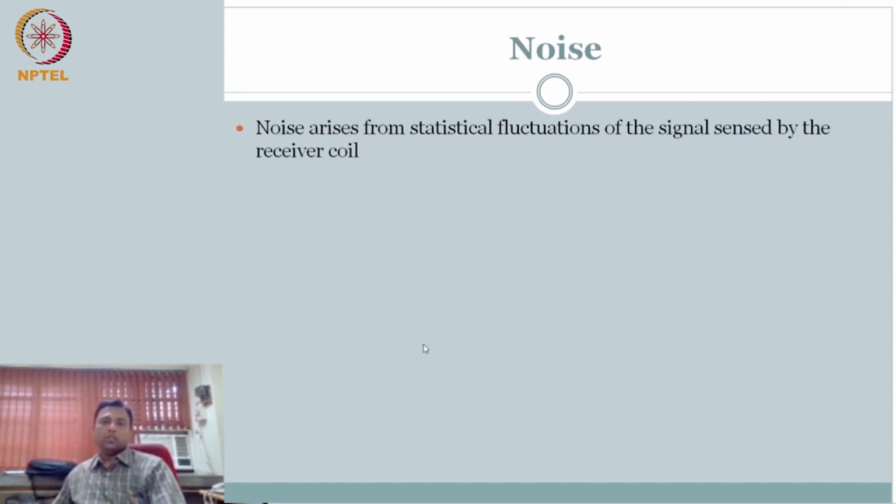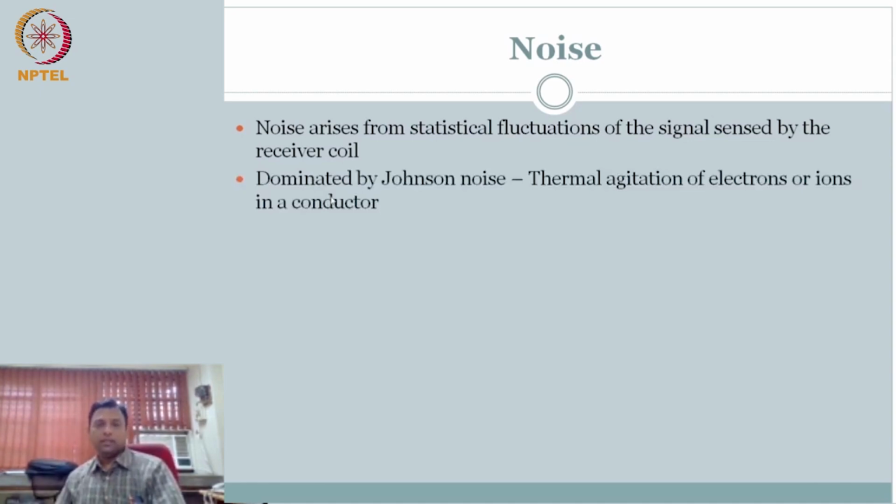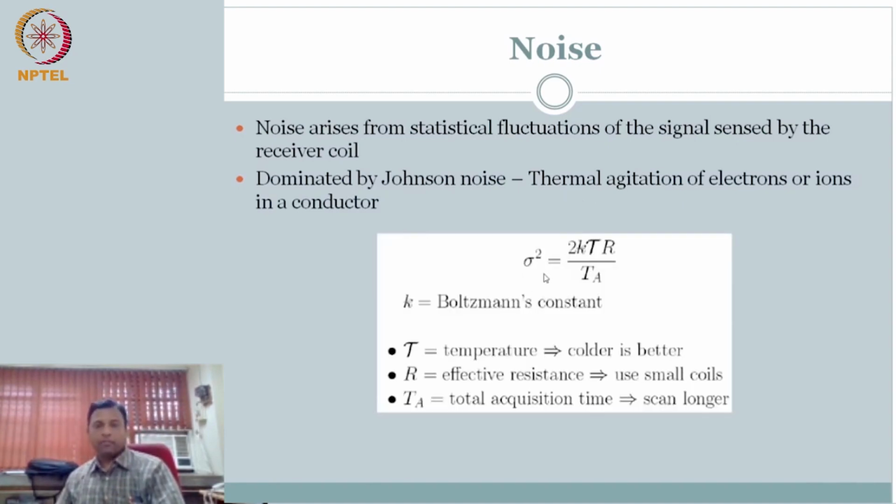Okay. So noise. So where is the noise coming from here? The noise that we are interested to cover is coming from during the measurement. Here we do only one measurement. What is that measurement? We are using a receive coil and receiving the data. That's the only place we are actually doing measurement. After that, you digitize, you do all computation. So the only data noise that comes during data acquisition comes from your receiver coil, and that too is a well characterized statistical fluctuation, because when you have a receiver coil and you are doing this operation, it gets heated up. So noise essentially comes from very well modeled Johnson noise or thermal agitation in electronics. Okay, so there is a noise model for this.